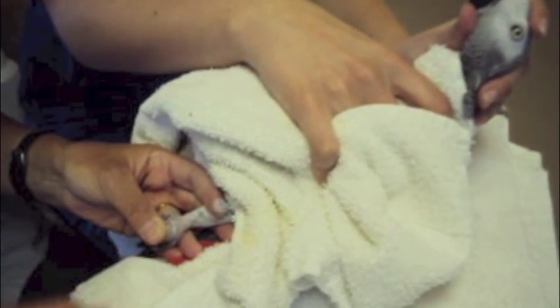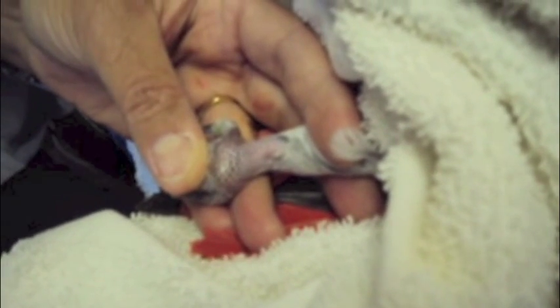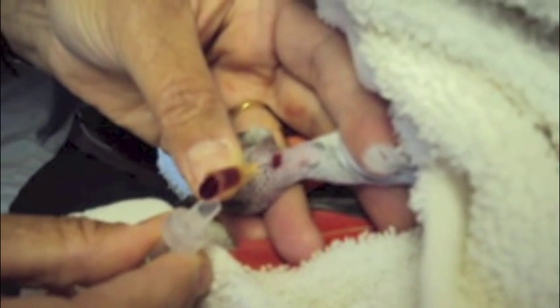Here we have Kasuku, who's wrapped up lightly in a towel and the technician is holding her. She's tolerating this quite well even though she's not a bird that's used to being handled. I'm going to wipe down the area with a little bit of alcohol and put a bit of compression on top of the vein that we can see there. I'll show you in slow motion — I poke through the skin right there. Sometimes it's more obvious on younger birds; on older birds or birds that are anemic, it's not quite as obvious if the skin is thickened.